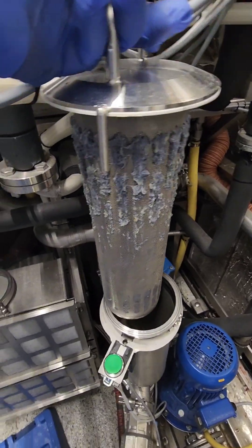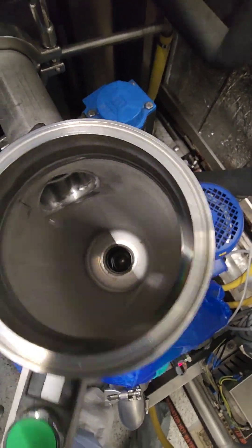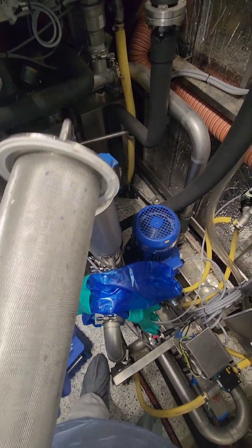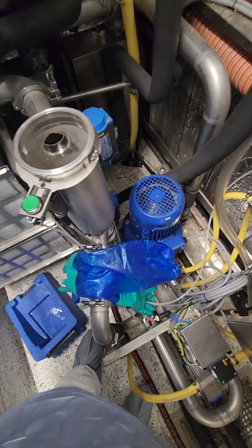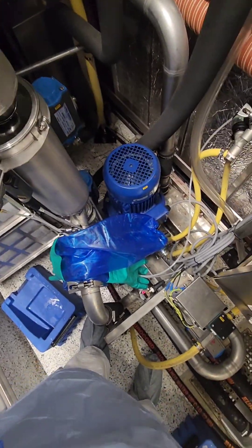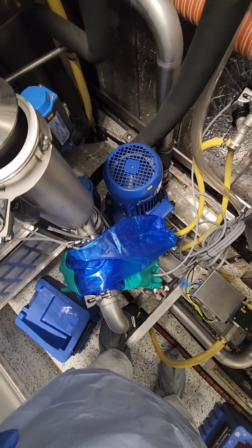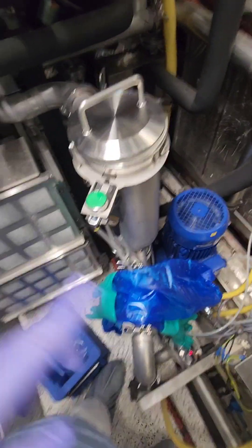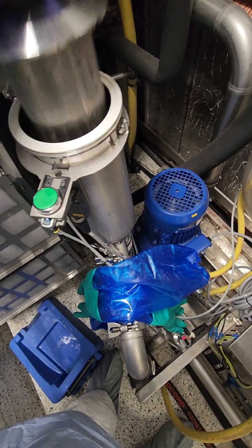As you can see, that filter is filthy — clearly hasn't been done in a while. We're going to clean it up, look inside the housing to make sure there's nothing left in there. Notice the difference — much better. Also see that white gasket right there? It's important that gasket is present; it stops any leaks or air from getting into the system.